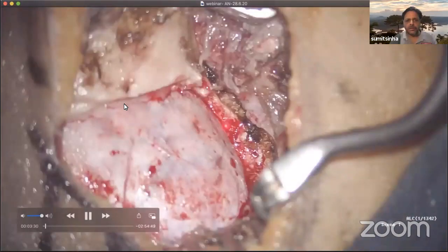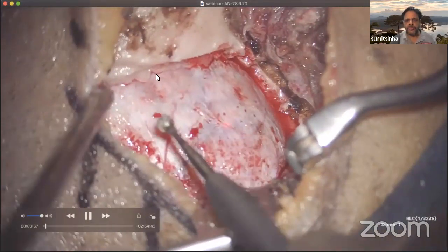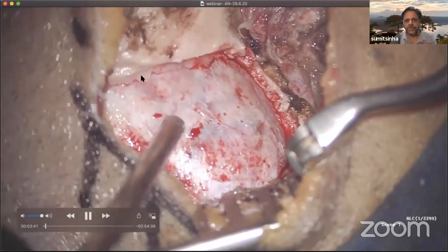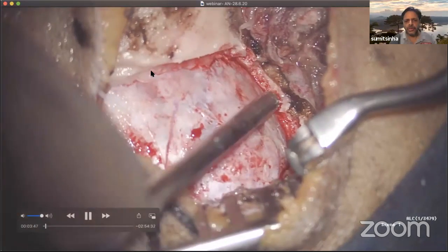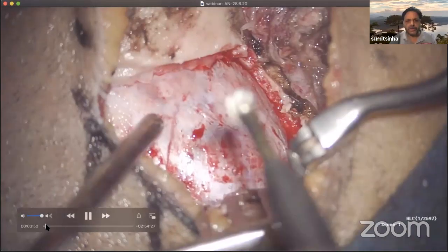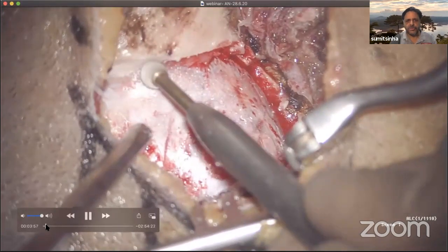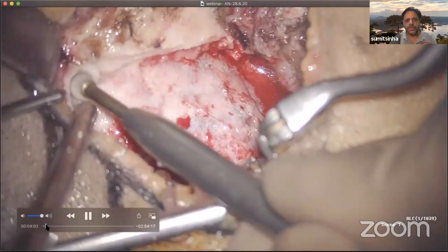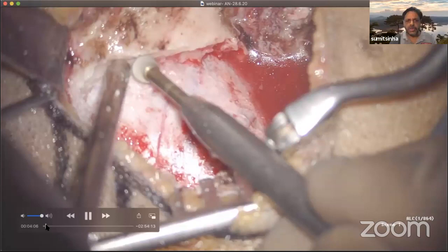And then I see here that there is some space. I cannot see the sigmoid sinus over here, and therefore you have to drill this type of bone also. By means of a drill, you have to drill it a bit, and you take the drill bit. You can take a diamond drill bit, which is safer as compared to a routine drill, because if it comes into contact with dura, then it might damage the dura. So it's up to you. If you take the diamond drill bit, it's better.